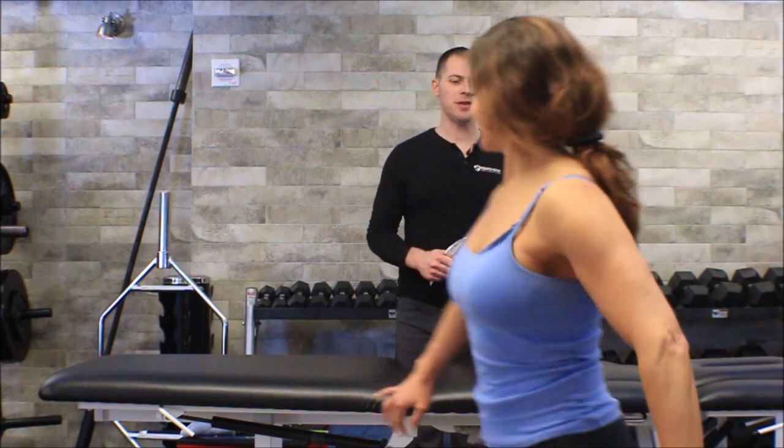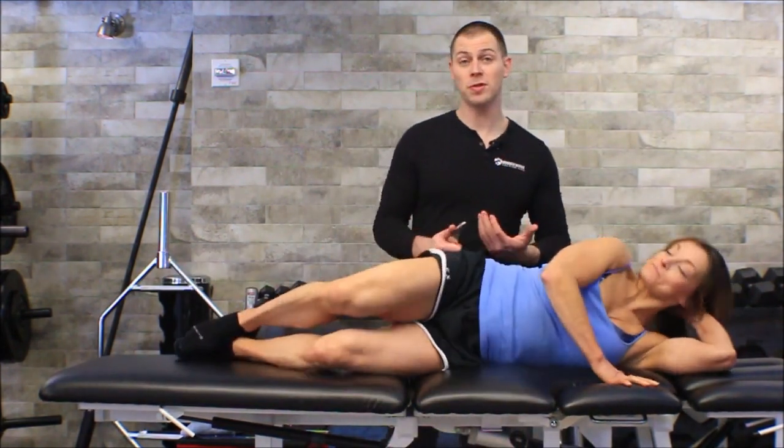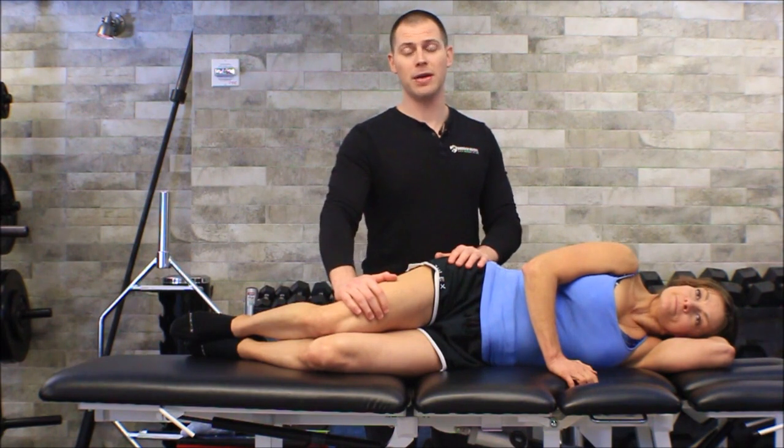In this video we're going to go after instrument assisted soft tissue mobilization for the lateral fasciolata. I'm going to have my friend Lisa come out to help me demonstrate. I know some of you are already thinking about the iliotibial band, and of course we will address the iliotibial band as part of the lateral fasciolata — that fascial layer that covers the lateral thigh.